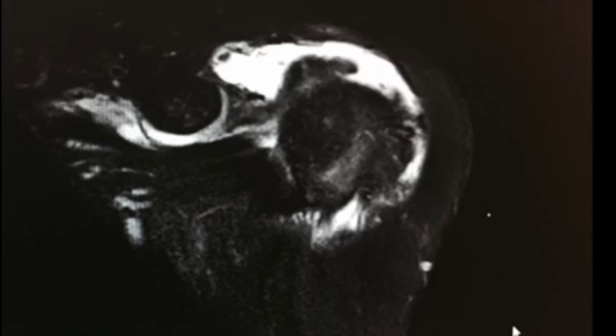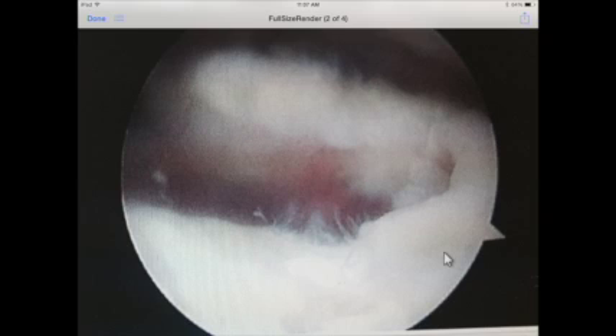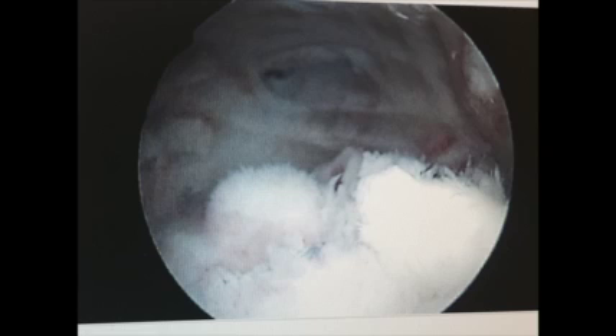Here's the preoperative MRI scan three months after the index operation, showing that he's gone on to a re-tear of the rotator cuff with significant retraction. The next image is my intraoperative photo demonstrating this large U-shaped rotator cuff tear of the supraspinatus and infraspinatus complex. The next slide demonstrates our marginal convergence repair demonstrating a near-watertight closure, with a final image demonstrating the rotation implant in position over top of the repair.